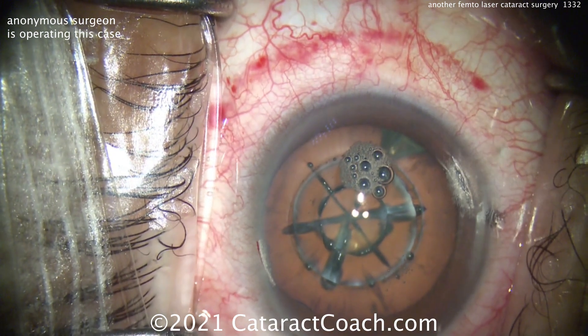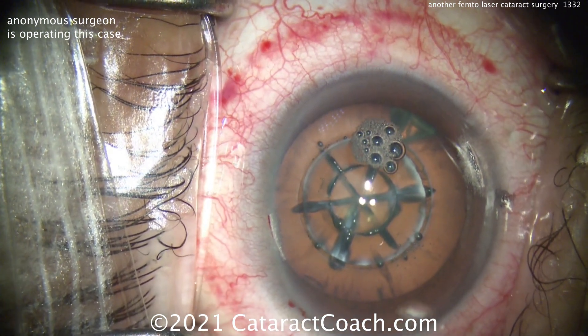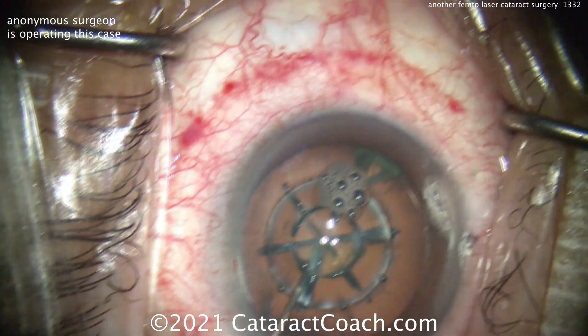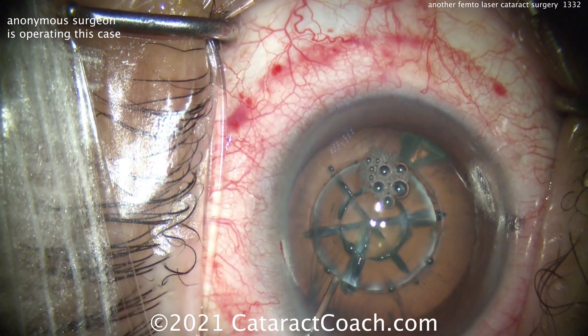Here's a side port blade being used to make a paracentesis. And you can see the nucleus has been divided up into six pieces, or sextants. And you can see a capsulotomy has been done also.